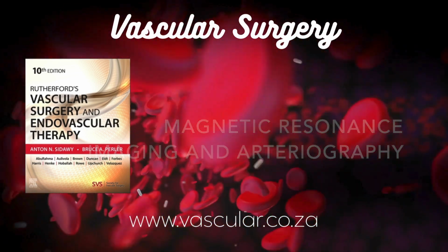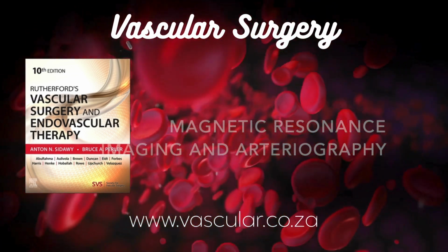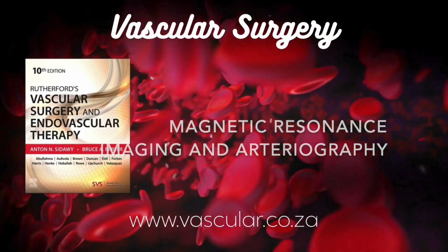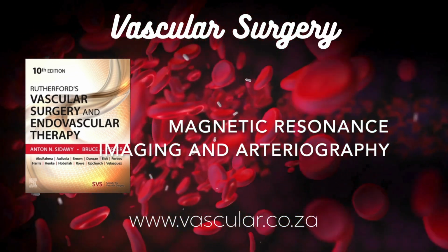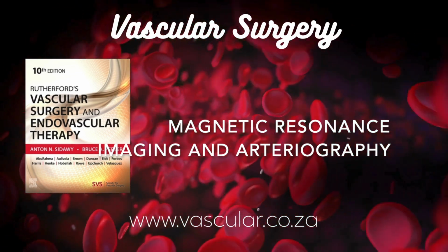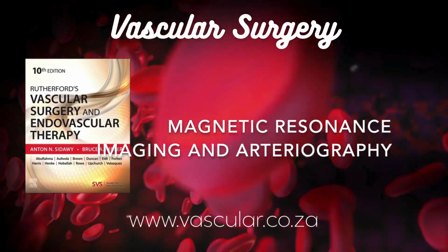The strong magnetic fields could pull on the device, heat up the leads, or interfere with its programming, potentially causing it to malfunction, pace incorrectly, or even deliver inappropriate shocks. The biggest fear is the device shutting down in a pacemaker-dependent patient. So scanning non-conditional devices is complex. Very. It involves device checks before and after, often reprogramming, continuous monitoring, having cardiology staff present.